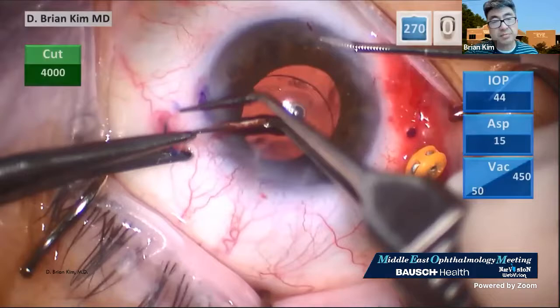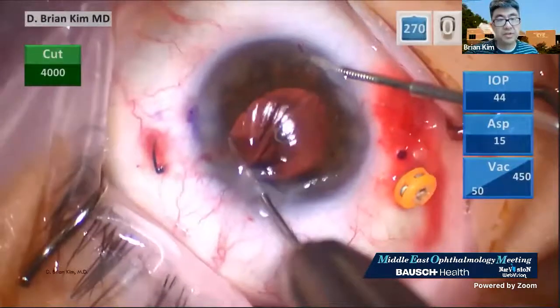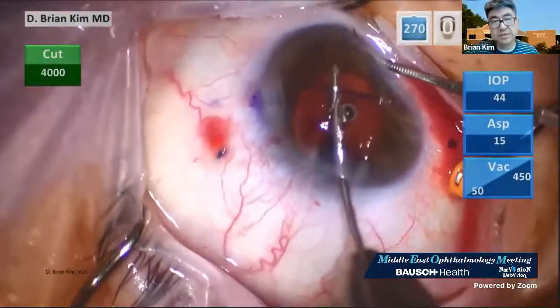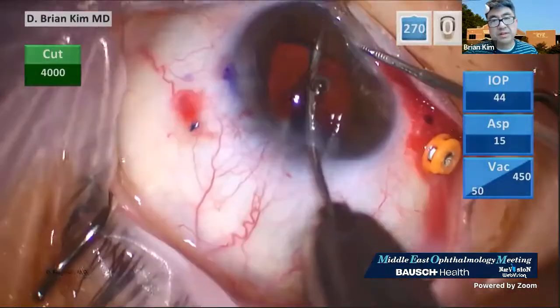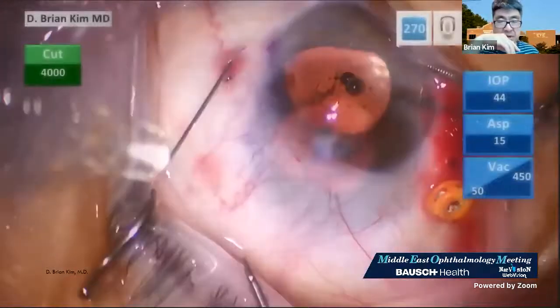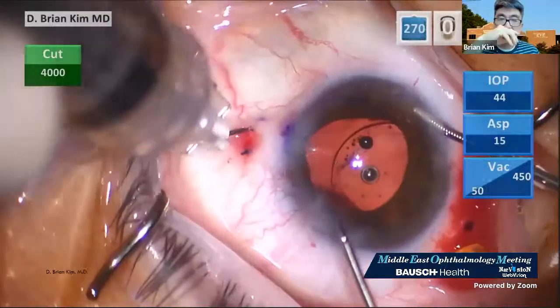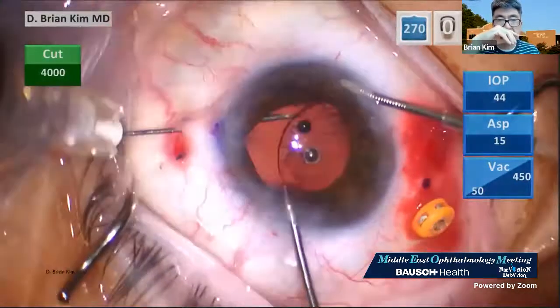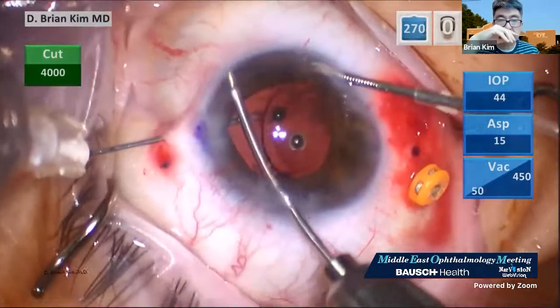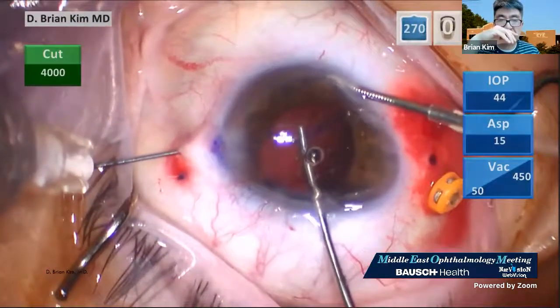So sometimes you have to pull it out and then go back in with microforceps and pull the haptic all the way into the vitreous space. You want to place it on top of the iris and then retunnel. Once you realize where you made your mistake, retunnel, grasp the haptic, dock it on the bevel of the needle, flatten it out, and then advance it.